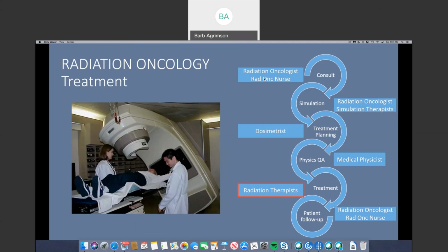The patient is positioned on the treatment table in the exact same position that they were in at the time of the simulation. The positioning devices that were fabricated at the simulation are all brought in and used when we treat the patient for their daily appointments. At this time, treatment images are taken and checked by the radiation oncologist before the first treatment is actually delivered.